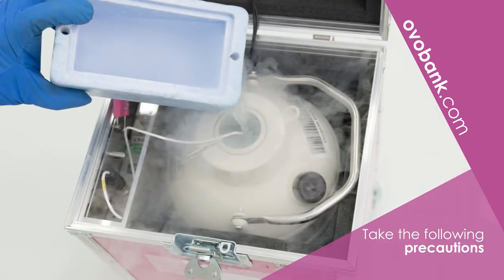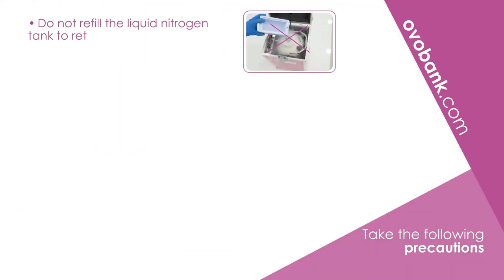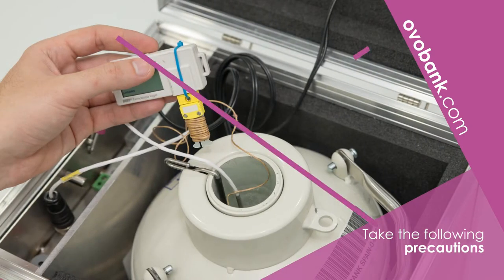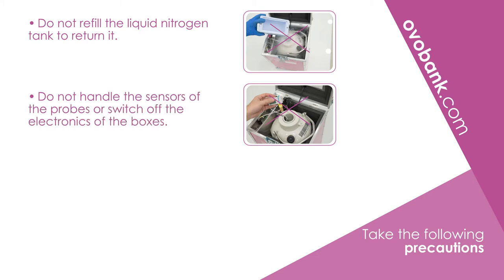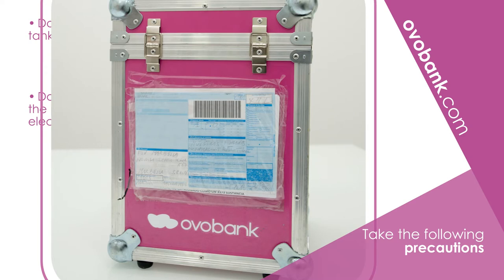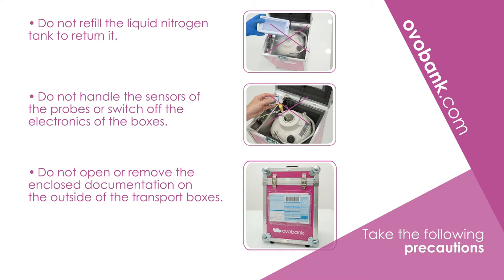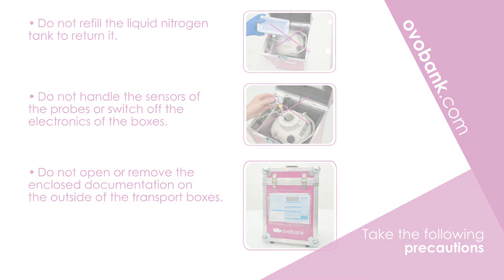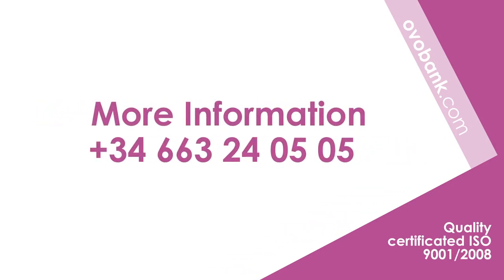Take the following precautions: do not refill the tank with liquid nitrogen to return it. Do not handle the sensors of the probes or switch off the electronics of the boxes. Do not open or remove the documentation attached to the outside of the transport boxes.